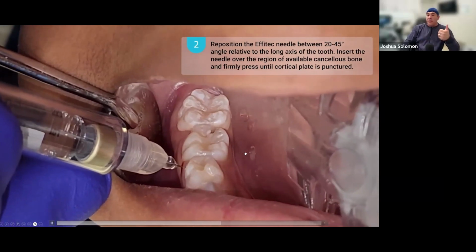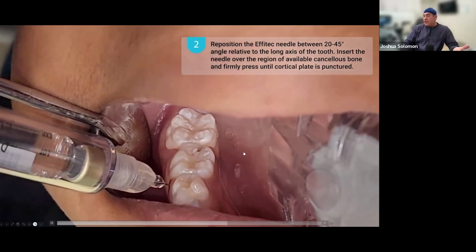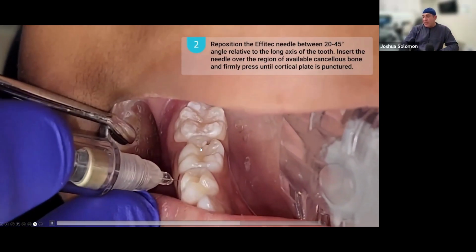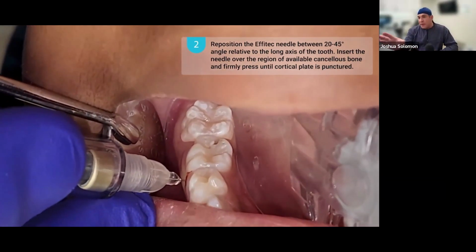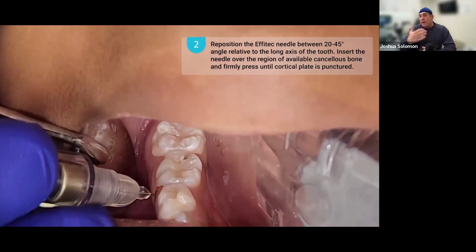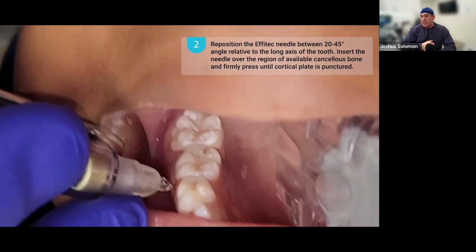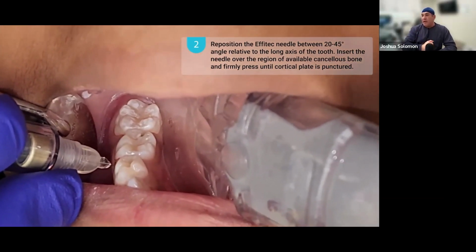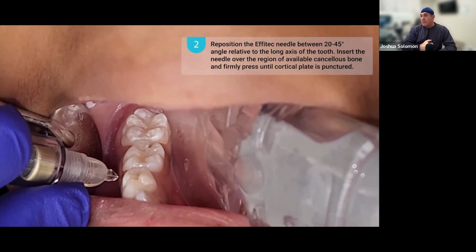Now, how much local anesthetic you're going to give depends on the procedure, the age of the patient, and the anatomy. I'll give you some general guidelines. We'll talk about it in detail in a little bit, but let's say I'm doing back-to-back restorations in S and T and maybe a small occlusal on number 30, I'm typically giving about a quarter carp of local anesthetic.